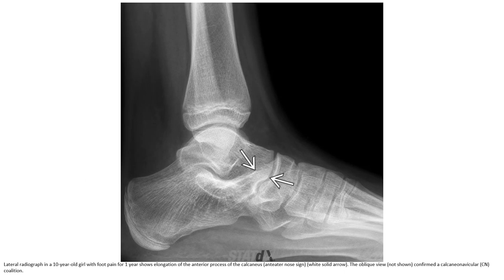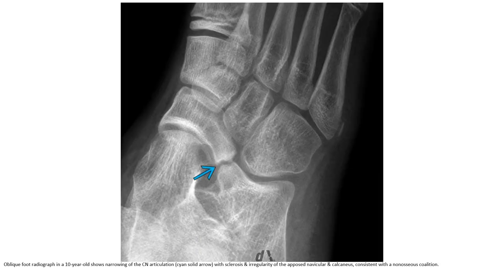This is a lateral radiograph of a 10-year-old with foot pain for one year. It shows elongation of the anterior process of the calcaneus. The oblique view confirmed the calcaneonavicular coalition. The CN articulation demonstrates sclerosis and irregularity on the oblique view of the navicular and calcaneus, consistent with non-osseous coalition.